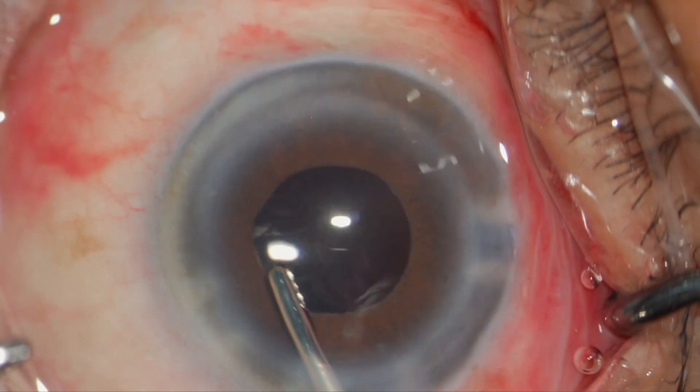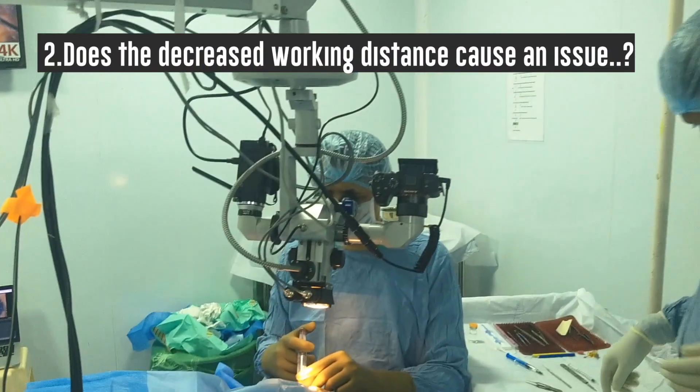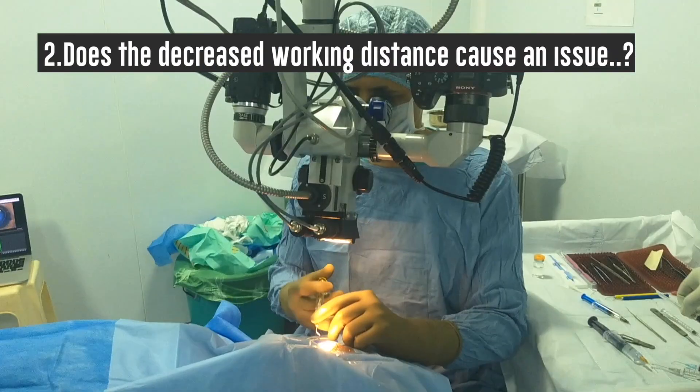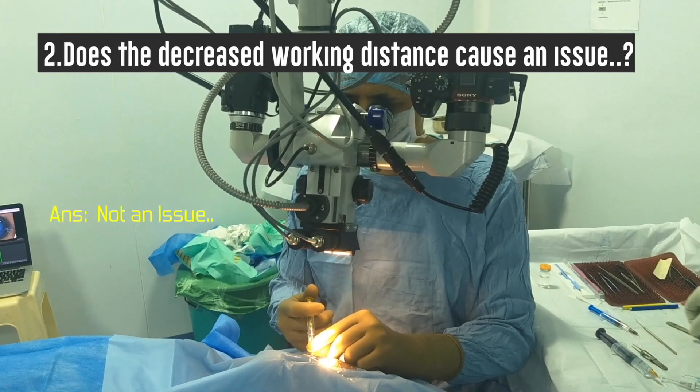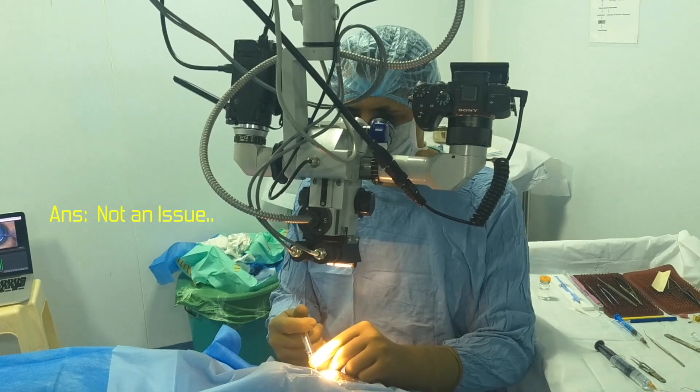Does it affect my working distance since it decreases the working distance? It does decrease the working distance marginally, but I think all of us will get adjusted in just a couple of cases. So it's not an issue.